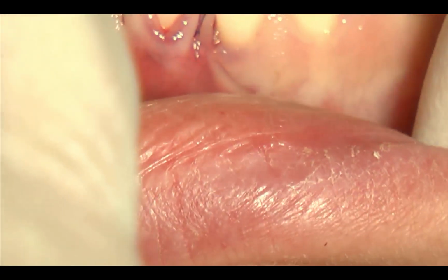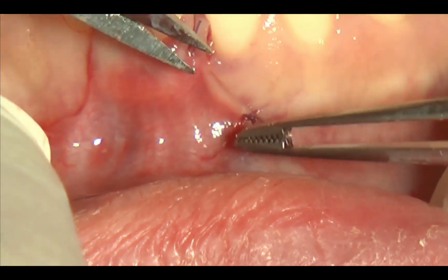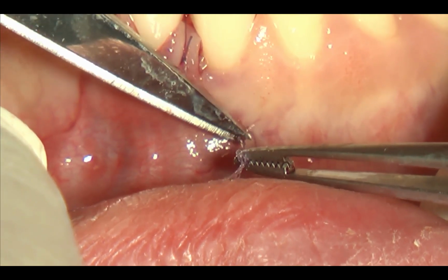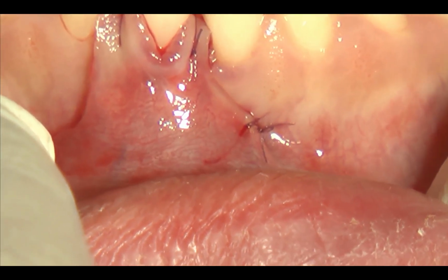Come se fosse la prima volta che lo facciamo. Tieni, dai. Verso il basso. E dai la struttura. Che un cazzo.